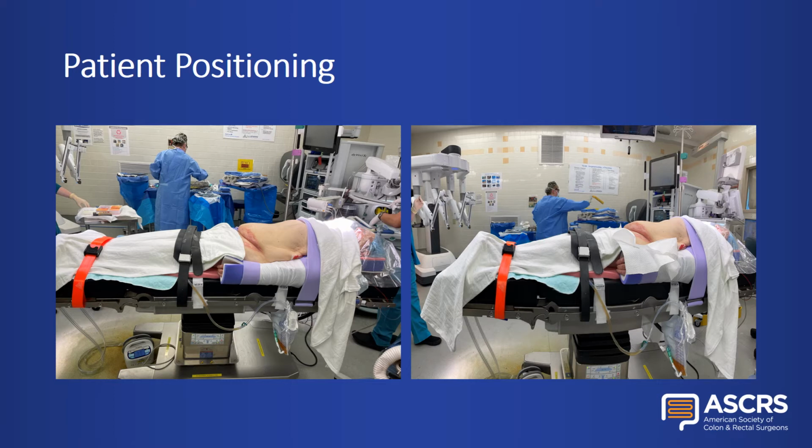Have the patient firmly secured to the operating room table. Tuck the arms and protect the face with foam or a face shield. Padding to the upper extremity should be performed to avoid any injury.